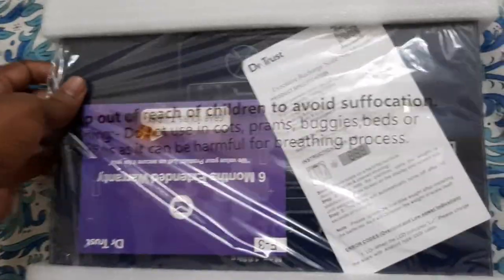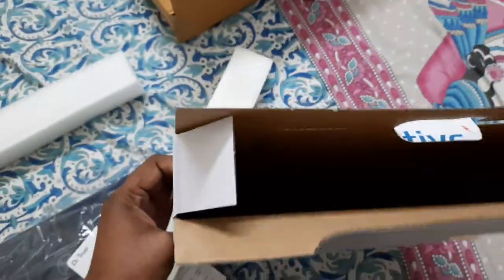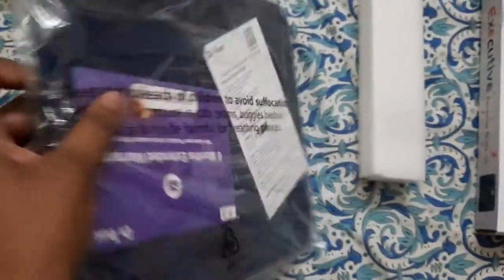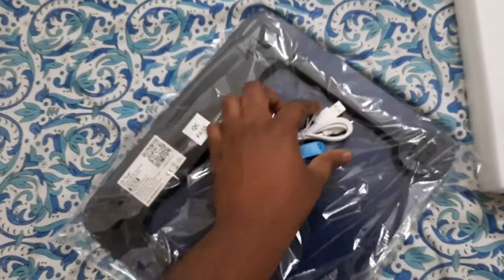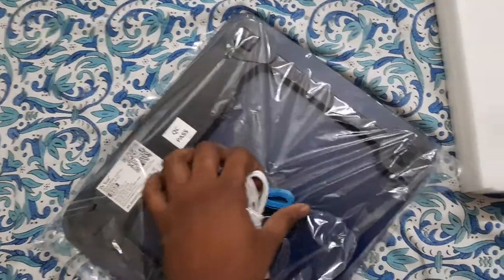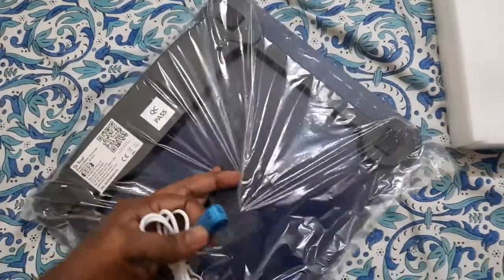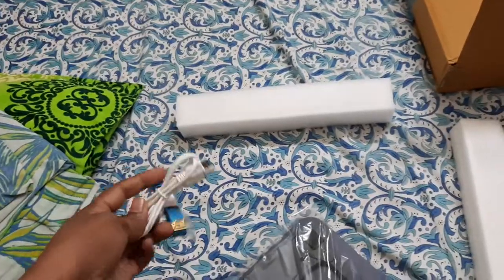I just opened it and this is everything we got — a USB cable and a charger with it, along with tape, so we can use it to charge by plugging into a laptop.